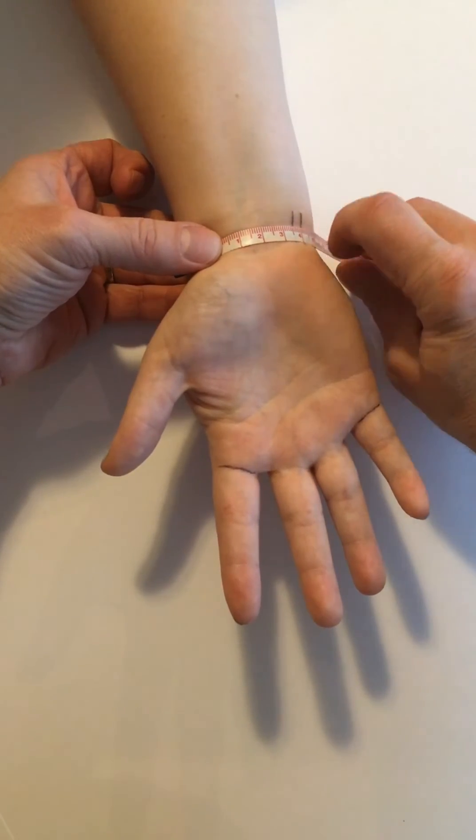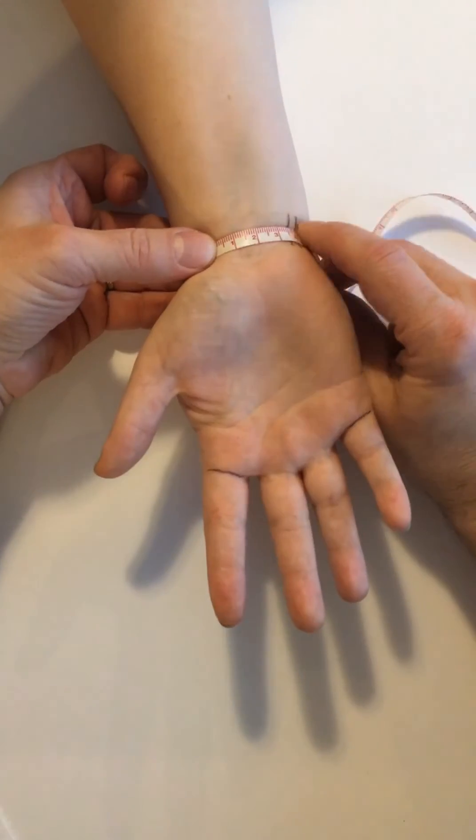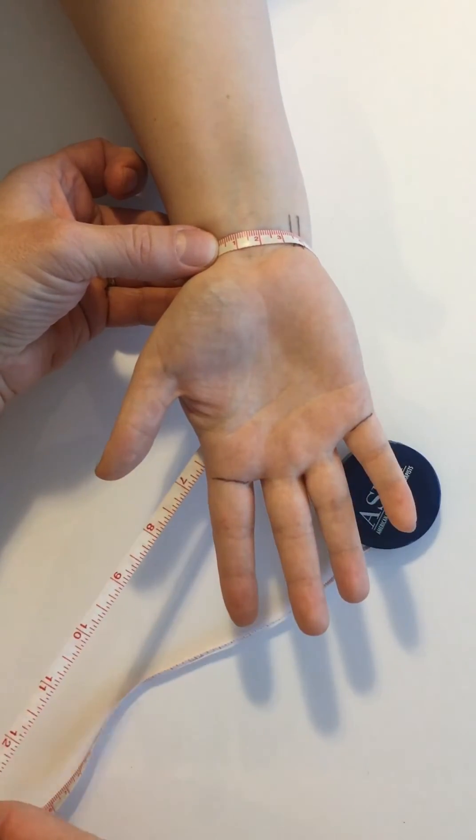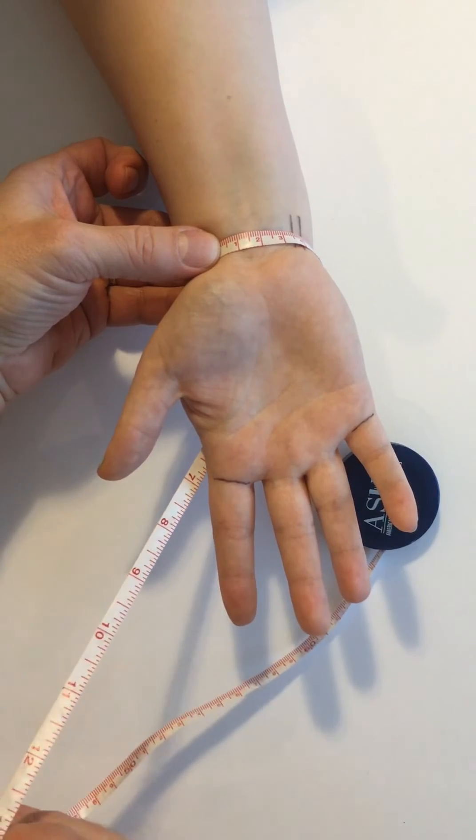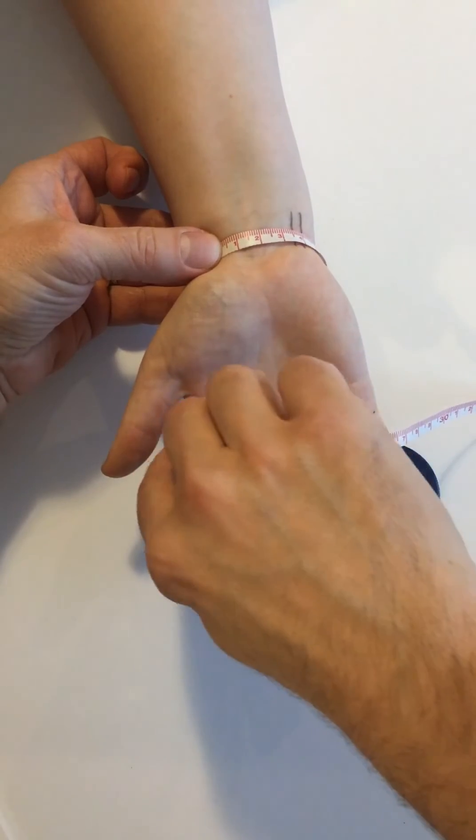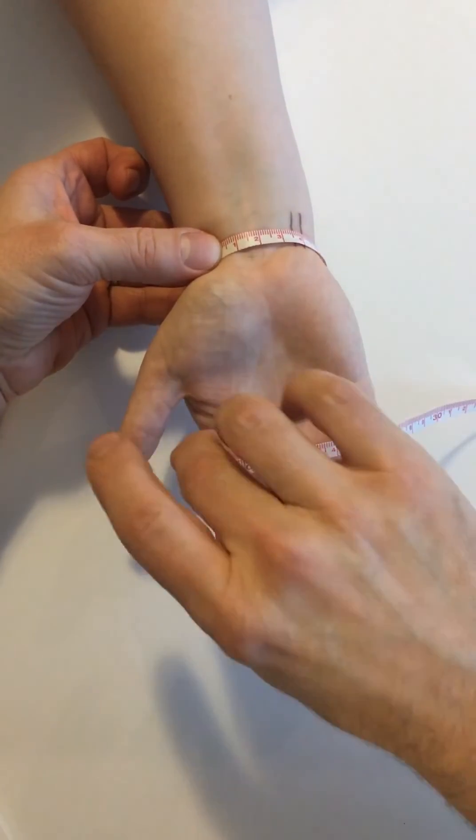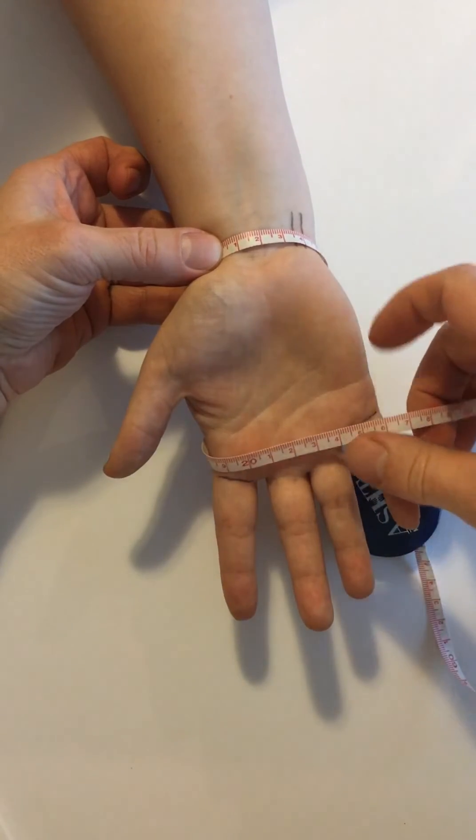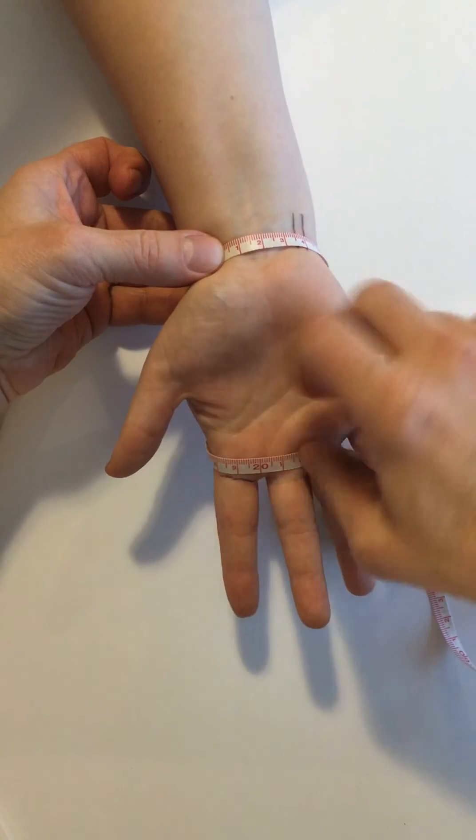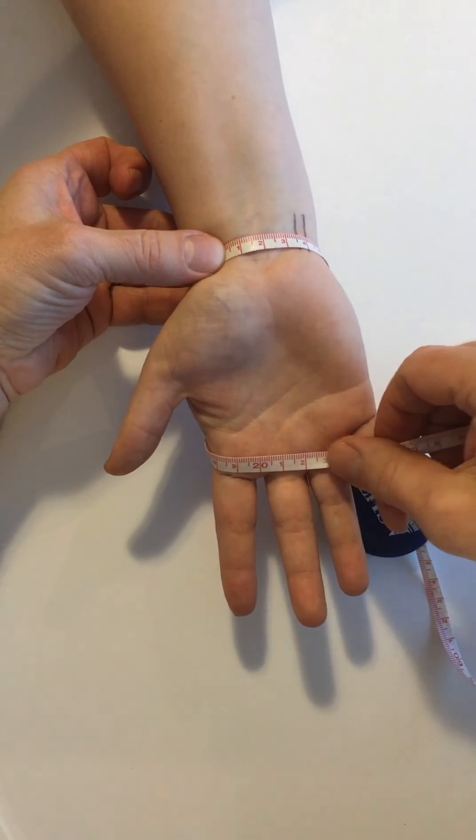Once we've crossed flexor carpi ulnaris we're going to take that and we're going to go obliquely and distally kind of an X across to the back of the hand there until we reach the second metacarpal. We'll go right through the midpoint of the second metacarpal head so that when we bring our tape across the palm we are just on the proximal edge of that palmer digital crease.